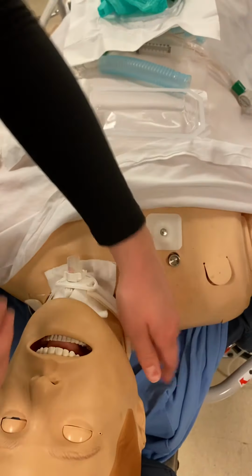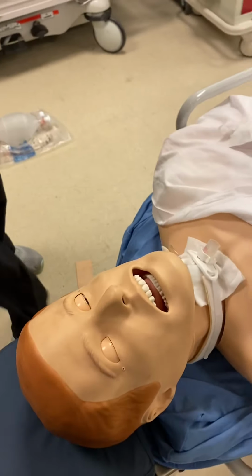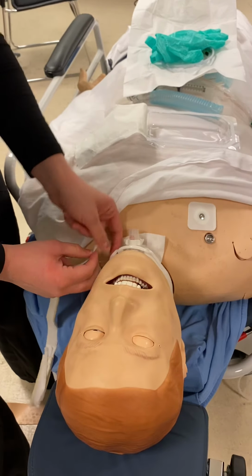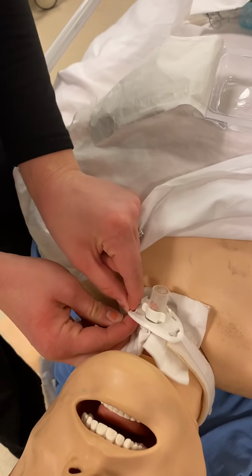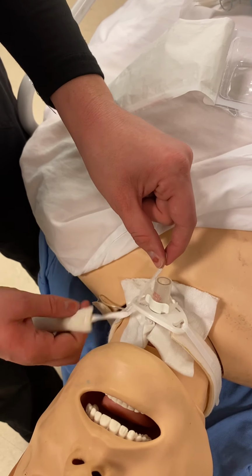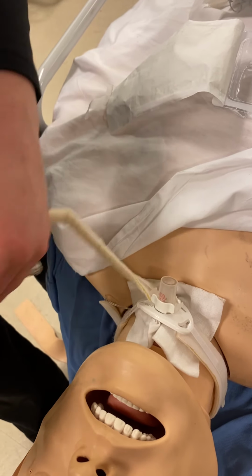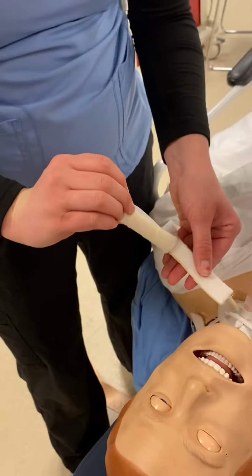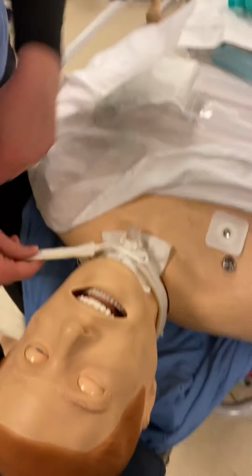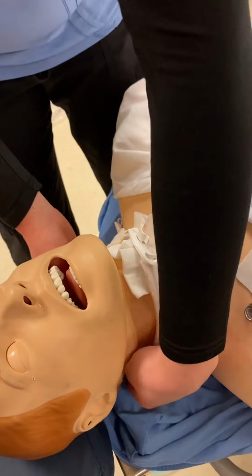Something that I like to do in a trick, if you don't have a second hand, is to get your second trach tie, and actually put it around your patient's trach before you take the old one off. So you're just gonna thread the one side through, and you're gonna secure it here. These have a little expander so you can make it the correct size for your patient. And the reason why that's important is we don't want to compress the cervical veins or arteries, because we want to allow for blood flow and drainage in the brain.